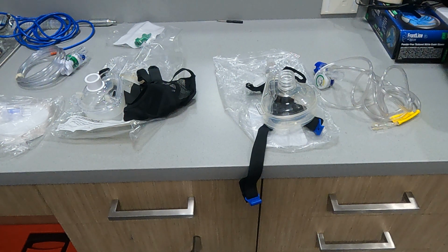That's important because what we're trying to accomplish with CPAP is we're trying to deliver PEEP to the patient, positive end expiratory pressure. So that gives your patient pressure to breathe out against. This is important because we're trying to use that pressure to splint their airways open so that when they breathe out, those airways can't collapse. We force them to stay open, thus making it easier for them to breathe.